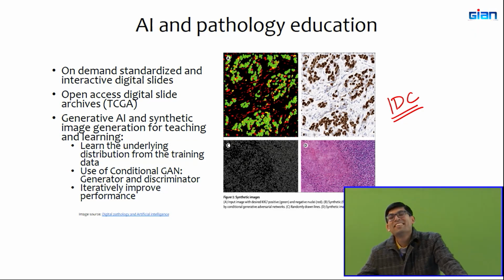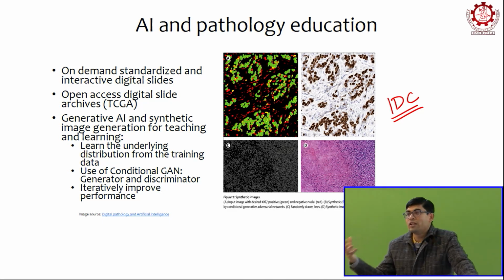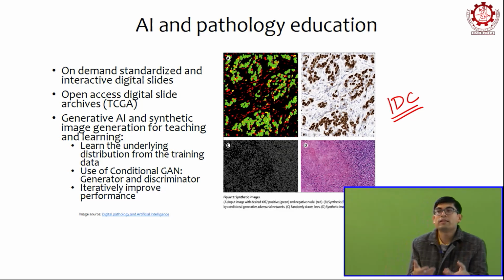Okay. So these images have to be blessed by pathologists. I mean, these images have to look real, right? It's not just generating a synthetic image. It has to show proper characteristics of disease. If there's a certain level of tumor infiltrating lymphocytes or a certain level of cancerous tissue that has to be seen, then the generated image also has to show that degree of faithfulness. You can't just generate any image with a prompt that says generate image of XYZ cancer and assume that it actually does that. You have to verify that with your pathologist.